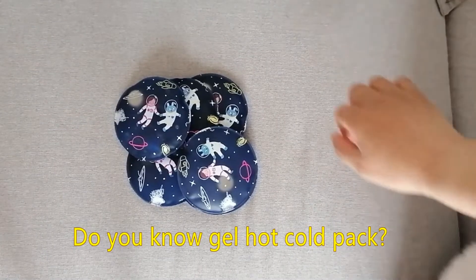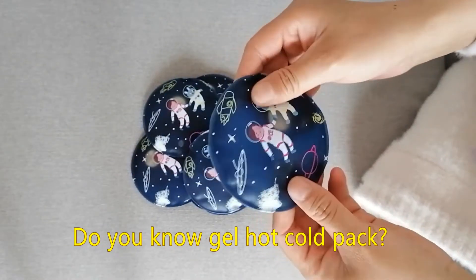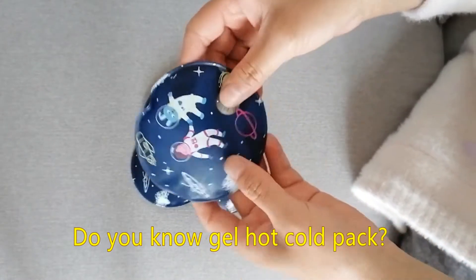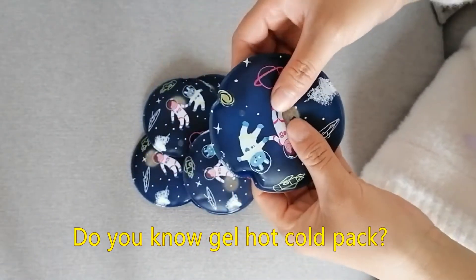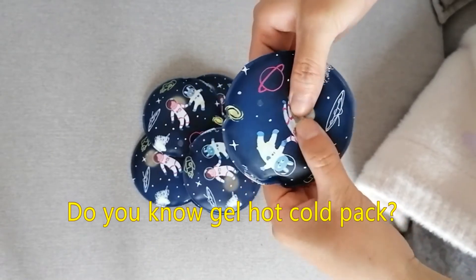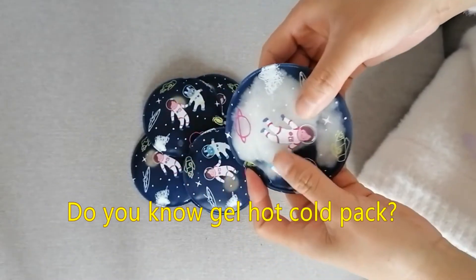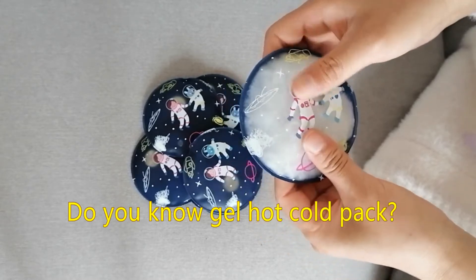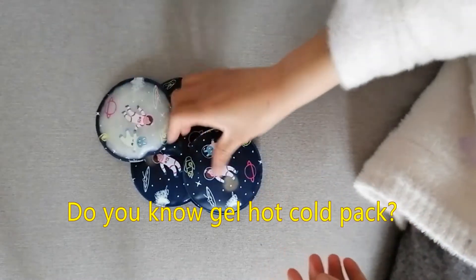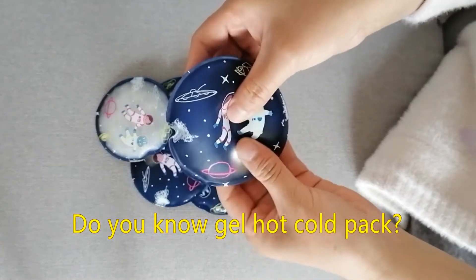Do you know gel hot cold pack? Suitable for kinds of hot cold physical therapy, sports, brain cold hot use, fever cooling. Hot cold pack suitable for arms, legs, waist, head, shoulder.